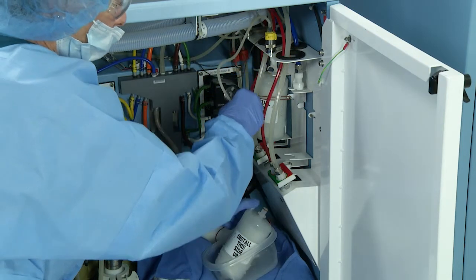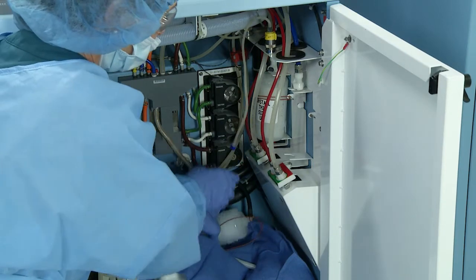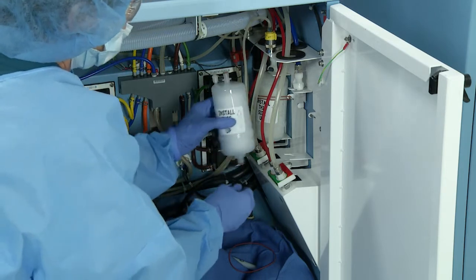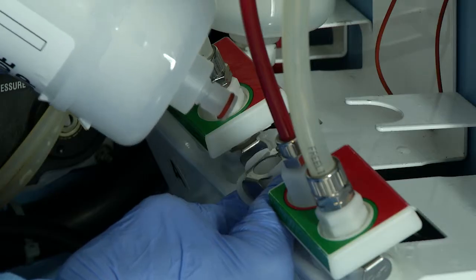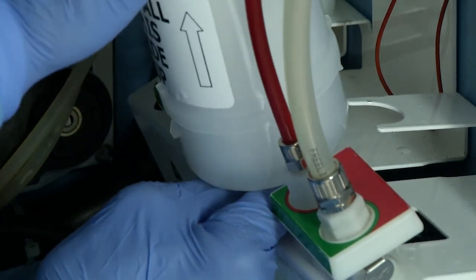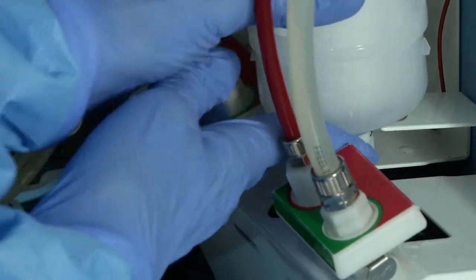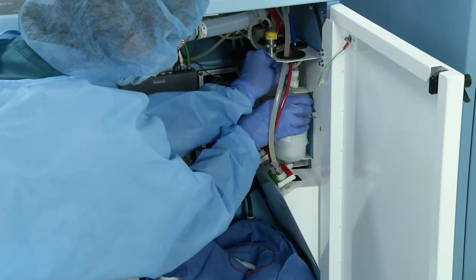Unfasten the twist connector on the top front of the filter. Discard the filter housing according to your facility's policy. Fit the new filter into place and make sure the arrows on the filter housing point up. Then refasten the connectors to make sure they are firmly seated. And fasten the twist connector.